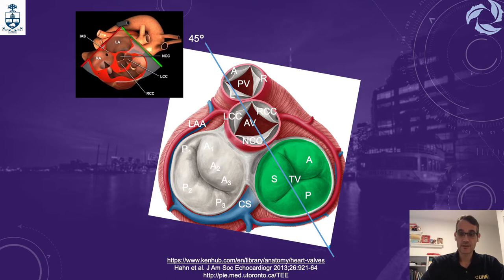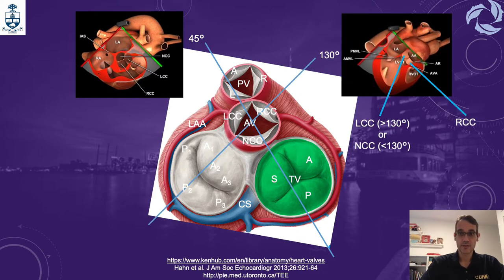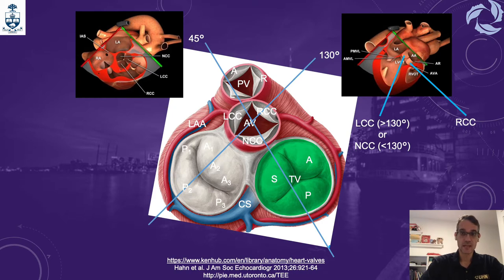At 130 degrees, we can see the mid-esophageal long axis view of the aortic valve, where the right coronary cusp is below and the upper cusps can be either the non or the left. The more the angle, the more likely it is to be the left. The less the angle, the more likely it is to be the non.